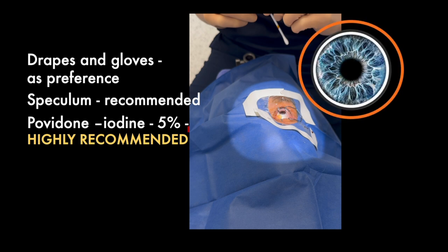Regarding the eye quadrant where the injection is administered, several articles have evaluated where it hurts less. Some recommend applying it in the superotemporal region. Many surgeons also prefer this area for comfort and better accessibility, and because many patients feel more at ease not seeing the syringe before the injection. Personally, I prefer to do it in the inferonasal quadrant. I have noticed that patients report less pain in this region, and I also have compared this in certain situations when injecting the same patient in the supranasal or superotemporal region versus the inferonasal region, and the latter reports less pain. I also ask the patients to look in the opposite direction from where I'm going to inject, and they don't see the syringe, so they don't feel anxious before the injection.